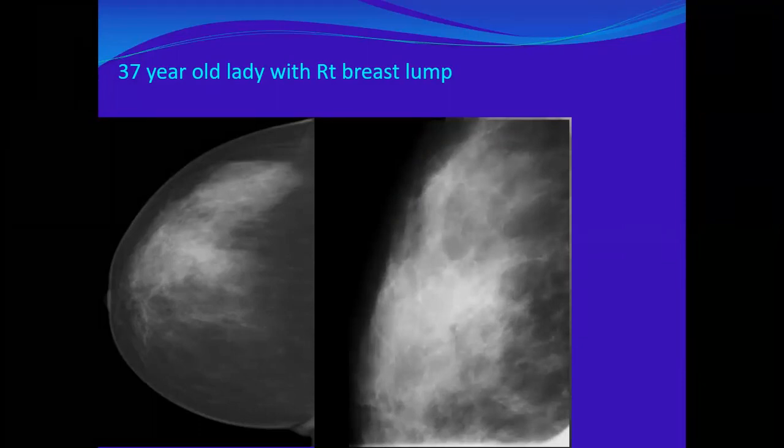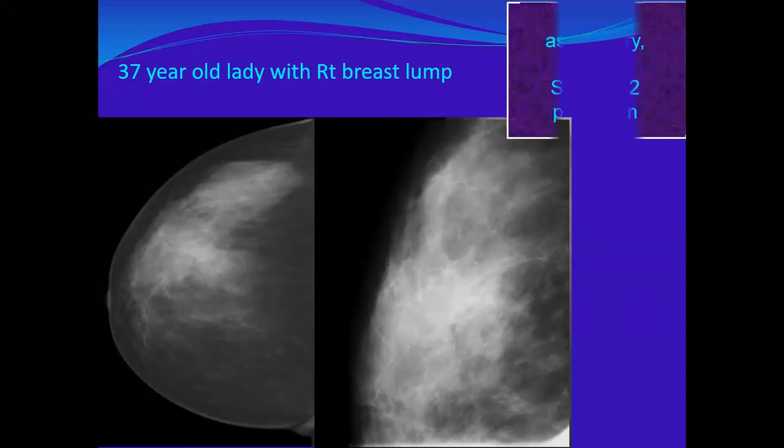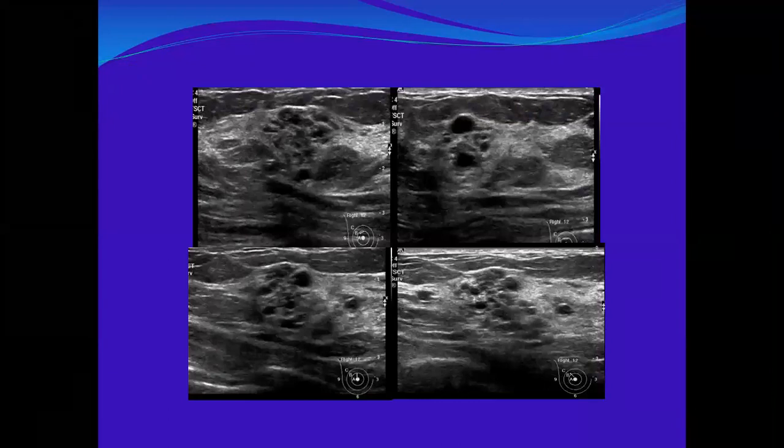It persists. Okay, it's a real focal asymmetry. So I will do targeted ultrasound. It is a real focal asymmetry, and I'll go for ultrasound. This is the ultrasound.